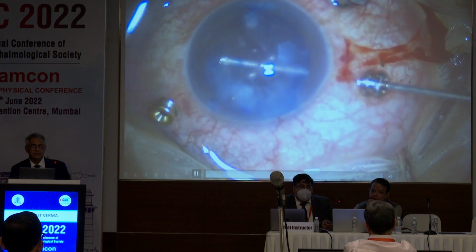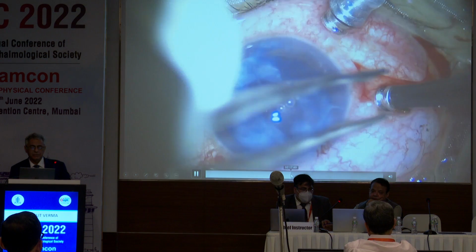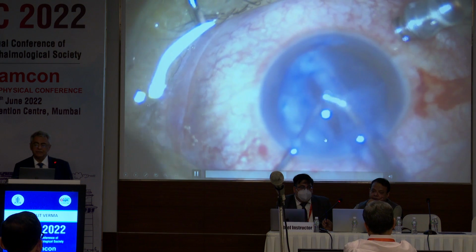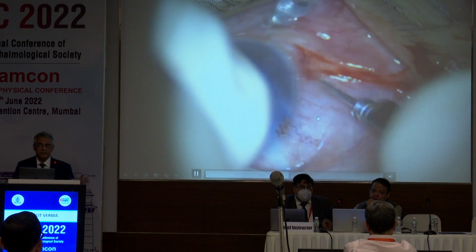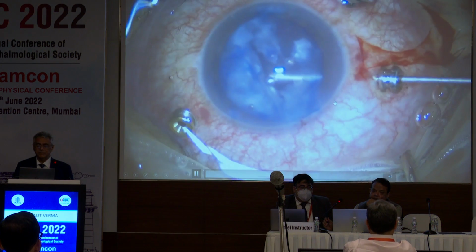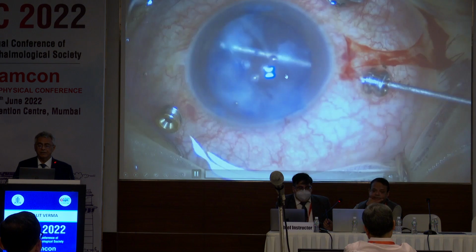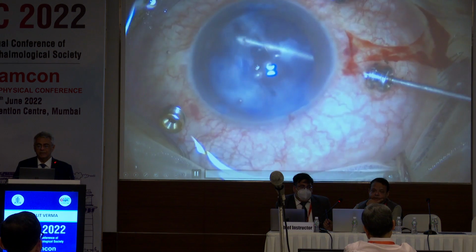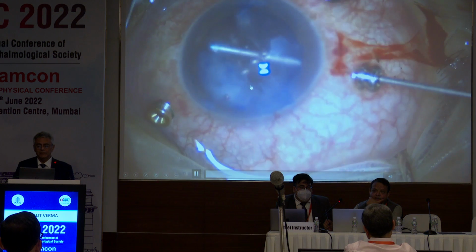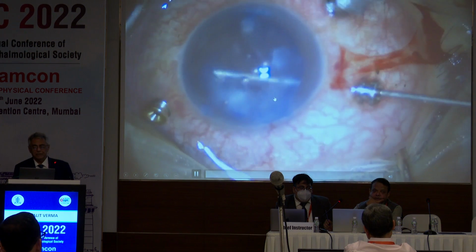Let me exemplify with this case AG was referring to. This was a patient who had a traumatic cataract, and we knew it is possible that the patient may have PCR or a pre-existing rent there. So this was the beginning of surgery, the rexis done, aspiration being tried, but since the vitreous and lens matter were admixed, it was not coming out. So that is when the posterior segment surgeon intervenes, makes all these ports, goes from pars plana 3.5 millimeter behind, makes all these 3 ports, and be very, very careful that you do not damage the capsular support, because that will support the lens, and take out this cortical matter. Use a mixture of both cutting suction and only suction sometimes, and remove this matter, which should not take much time.